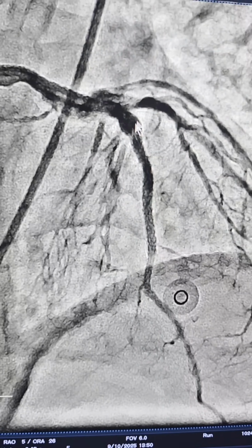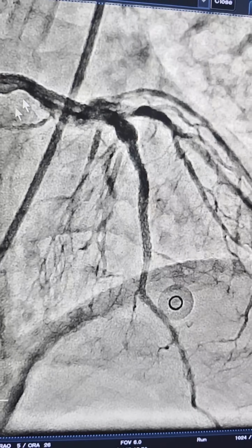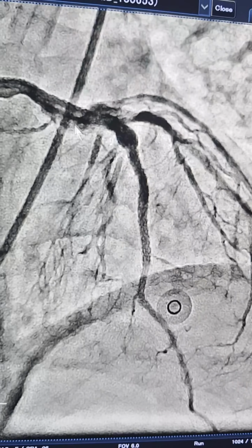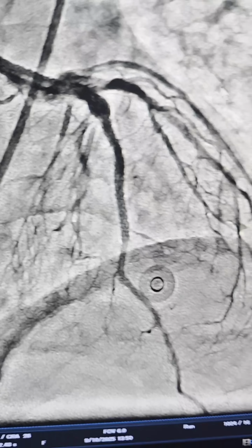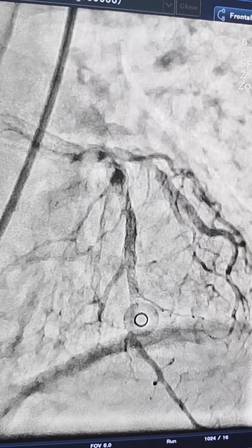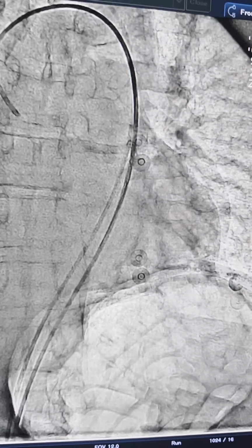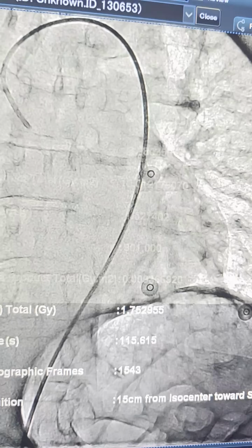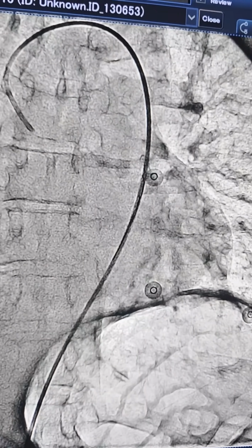We haven't crossed this aneurysm. We got a stent all the way down here, 5 millimeter, 3.5, 4 millimeter here, high pressure here, 2.5, and then optimized with 3 millimeter. All the circumflex is back, and the clot seems to have gone on Aggrastat. We just wanted this picture to see there's no pericardial effusion or anything.